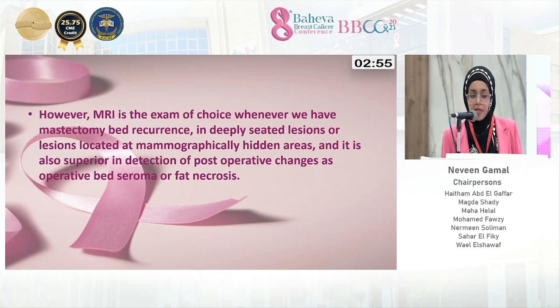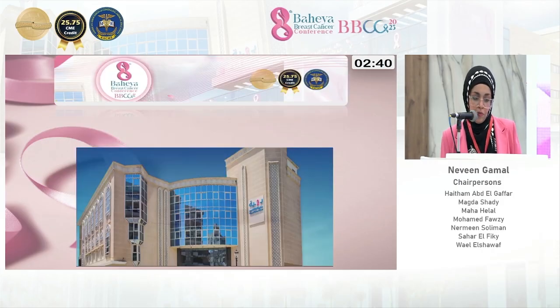However, MRI is the exam of choice whenever we have mastectomy bed recurrence in deeply seated lesions or lesions located at mammographically hidden areas. And it's also superior in detecting post-operative changes such as operative bed seromas or fat necrosis.